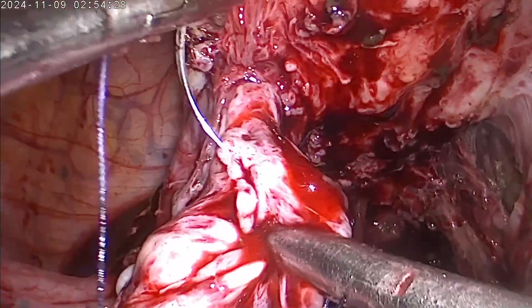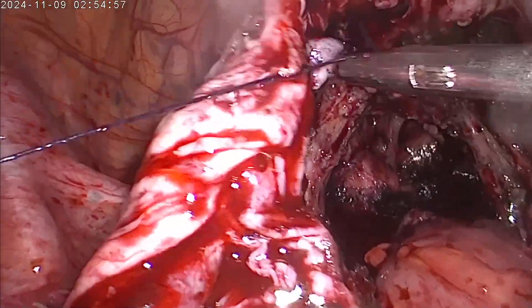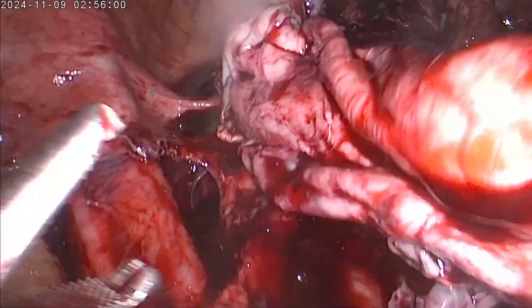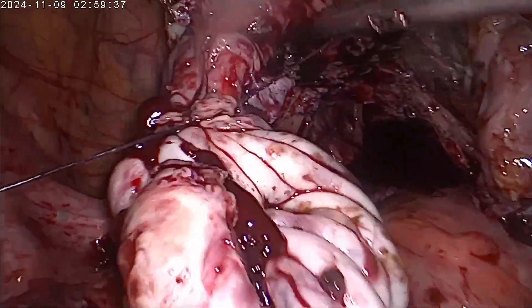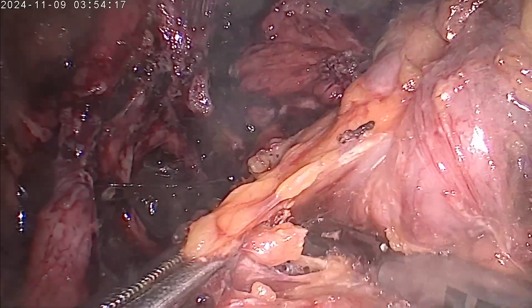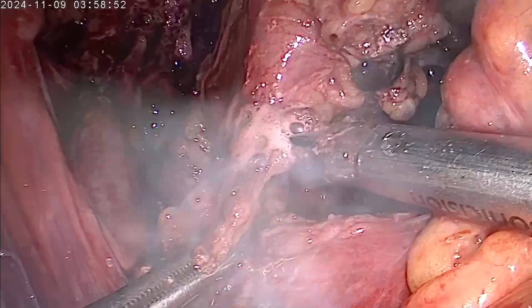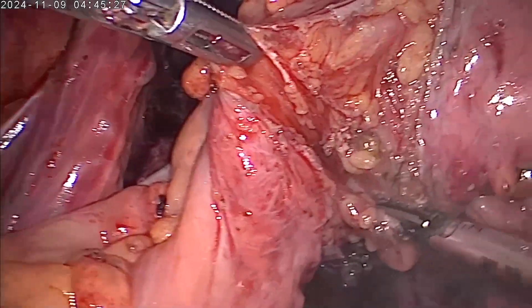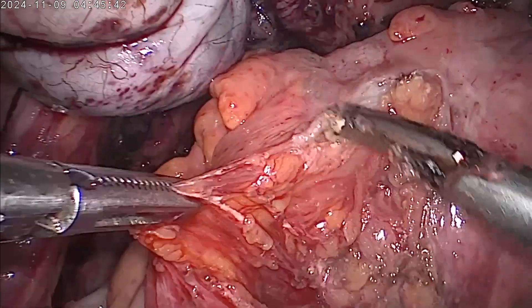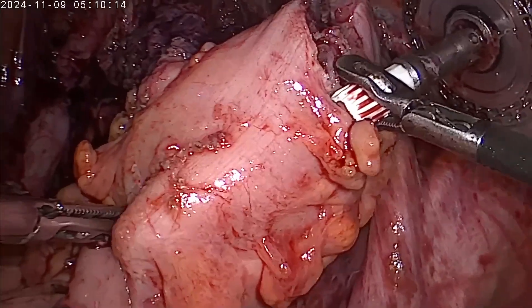Ovarian cystectomy is complete and the ovary is then restored to its normal anatomy by suturing. The proximal and the distal bowel segments are now being prepared for stapling. An opening is made on the proximal bowel to pass the anvil.